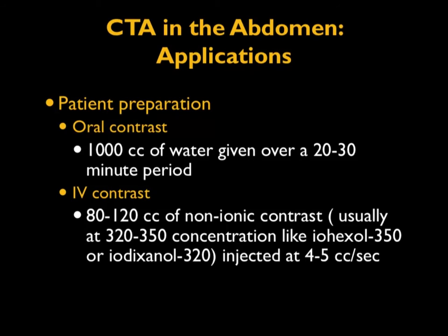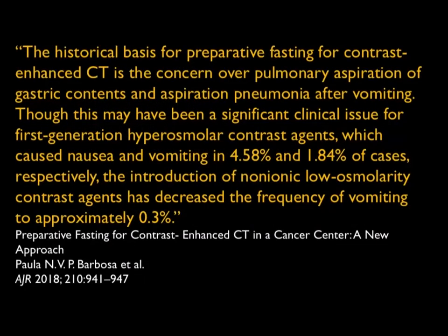In terms of how to scan the patients, in terms of prep, I'm not really interested in having the patients NPO. In fact, we want the patients hydrated, so we don't want NPO. But we prefer for about 2 to 3 hours not to eat any meals. There was a recent article talking about people fasting, and they were talking about some people fasting for 12 hours, and the concern always was vomiting, and we had that concern too, but it's typically not a problem, and hydrating patients and not keeping them NPO gets rid of the risk of contrast-induced nephropathy.